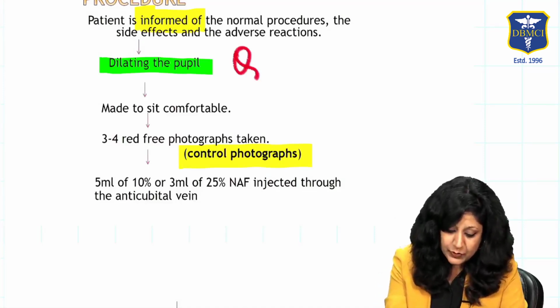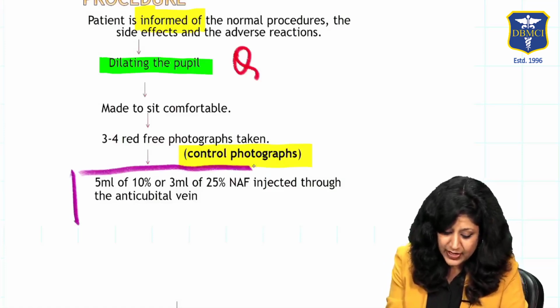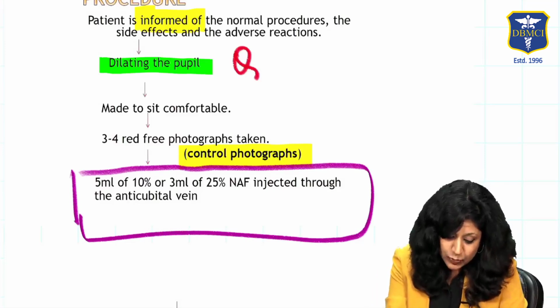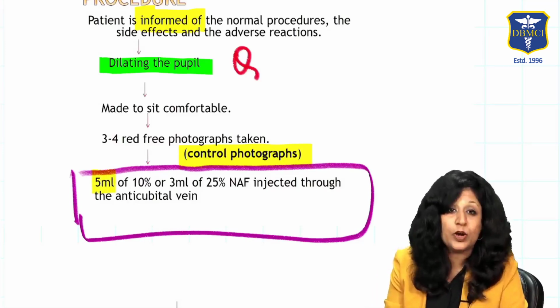Now, after doing this, I have to really inject the dye. Now, this step is very, very important. How much amount of dye should be taken? 5 ml. What you should take?